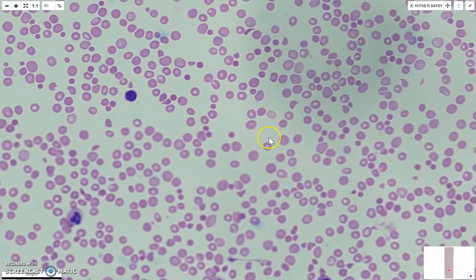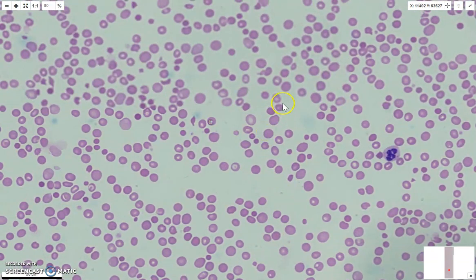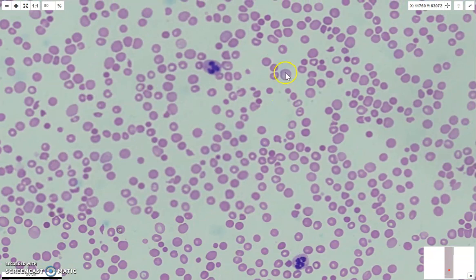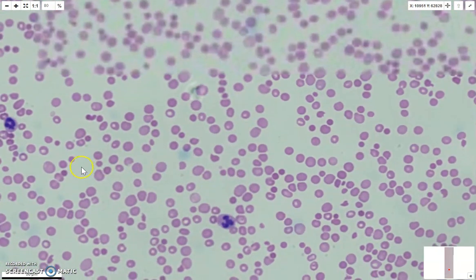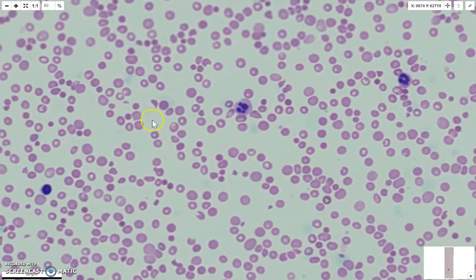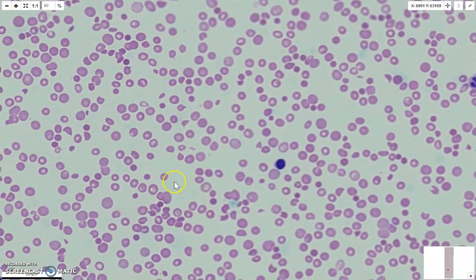When they get to a point of a lot of polychromasia, you can even see an occasional nucleated red cell, which is the orthochromatic erythroblast coming through. So that's that one for a MAHA, and she has been diagnosed with HUS, hemolytic uremic syndrome, and of course then they would be doing follow-up tests like the E. coli microbiology tests to see if she does indeed have that.